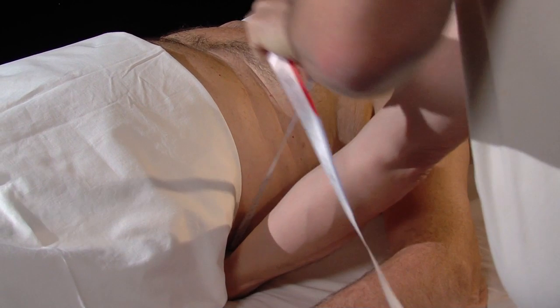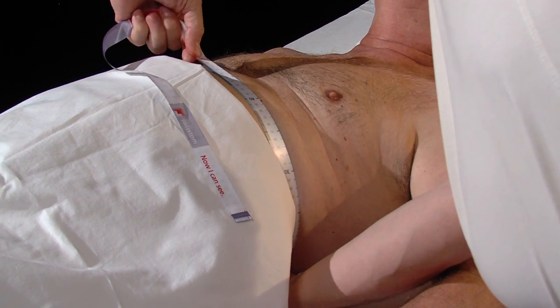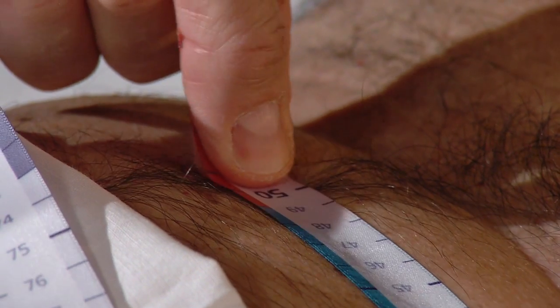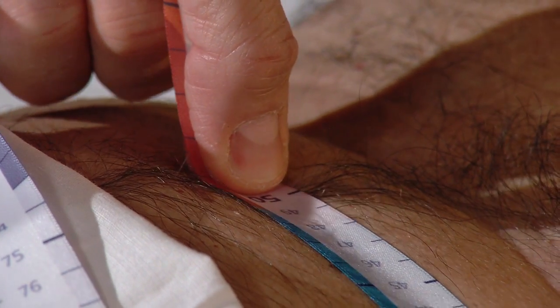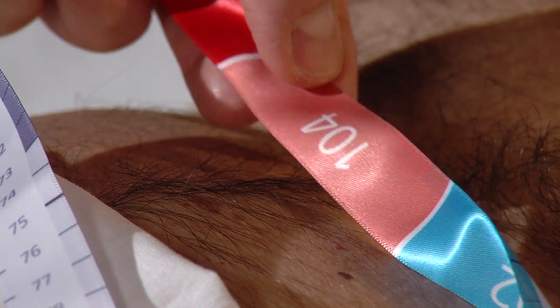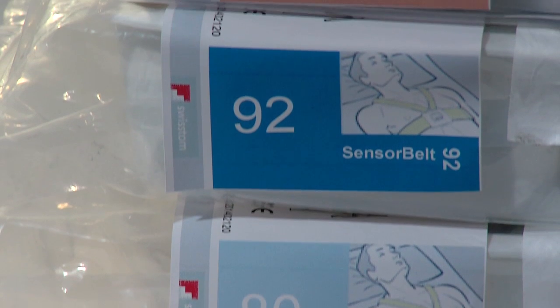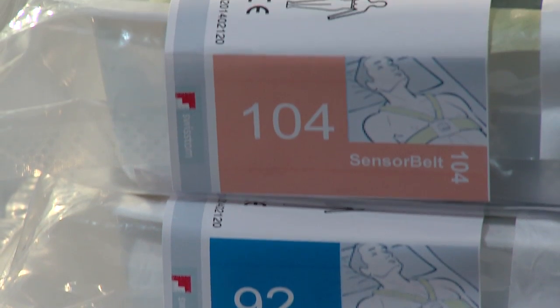Embrace the chest semi-perimeter from spine to mid sternum with the measuring tape and read half the chest circumference on the CM scale. In this example the value is 50 cm. Each centimeter value corresponds to a sensor belt size — the size here is 104.